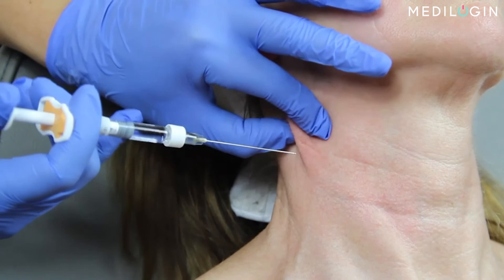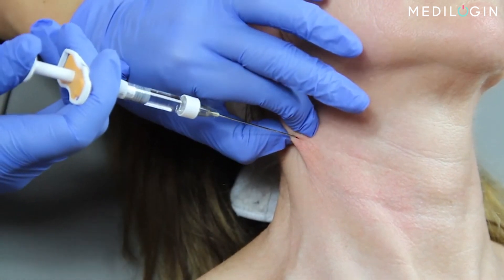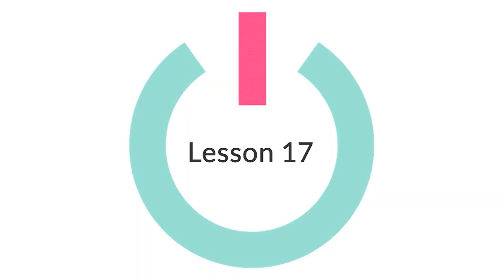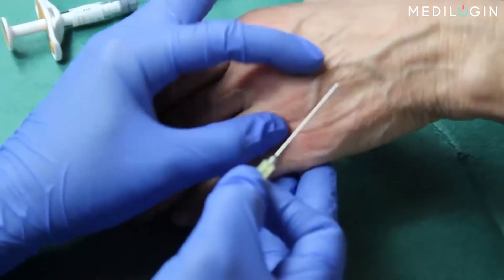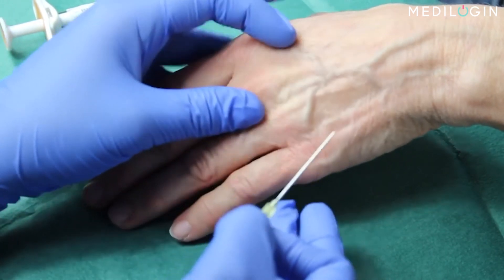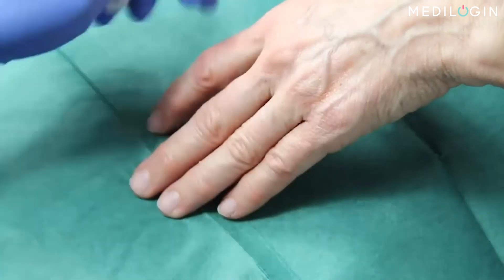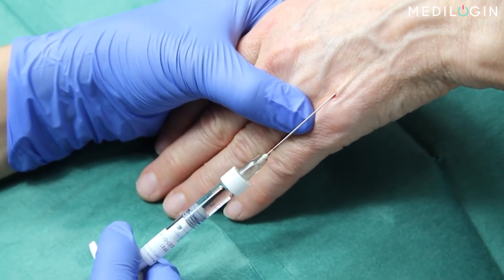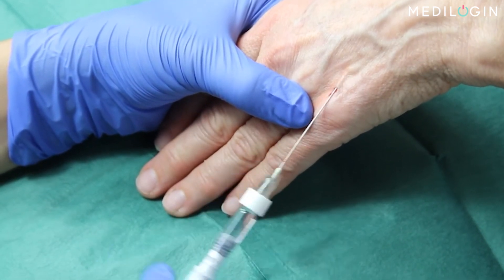In the event that you find yourself unable to advance the needle, remove it, and repeat the entire approach once more. The aesthetic treatment of the back of the hand using hyaluronic acid is one of the most asked-for treatments of this type. In this lesson, we'll show you how to systematically approach this popular patient request. Here we demonstrate the alternative method: using your left hand, grasp a fold of skin and use a sharp needle to create an entry port. Then switch to and gently insert the blunt needle, and apply a small volume of hyaluronic acid using the fanning technique.